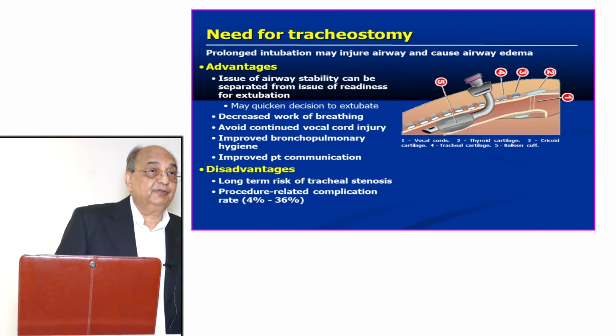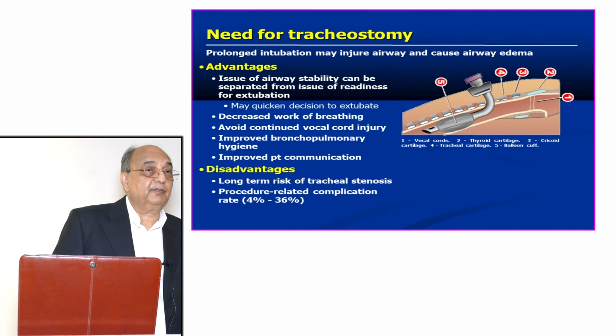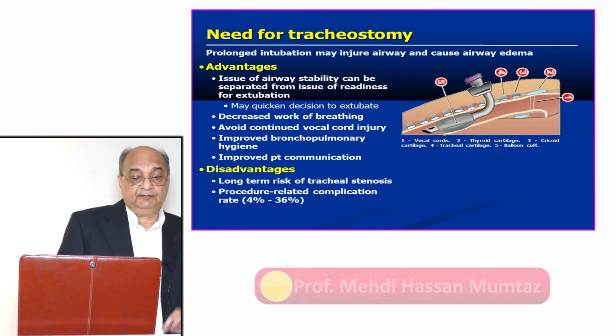Always make sure that you have sucked the secretions which are collected below the vocal cords above the cuff. After suction, then you deflate the cuff gradually, then keep it deflated intermittently. Make this your habit, so that you release the pressure on the mucosa, so that it should not cause permanent damage to the mucosa of the trachea.